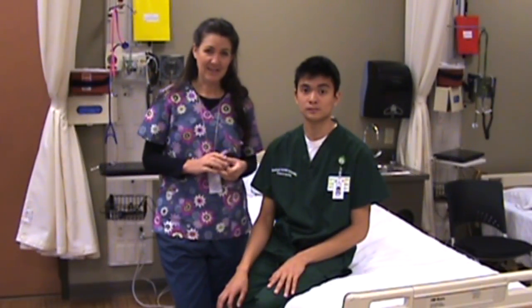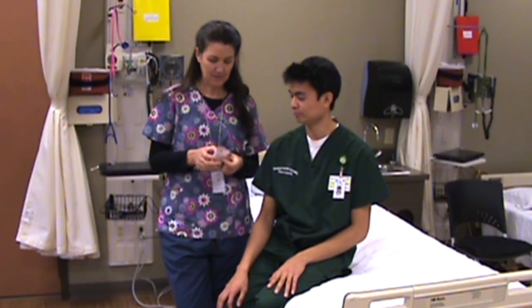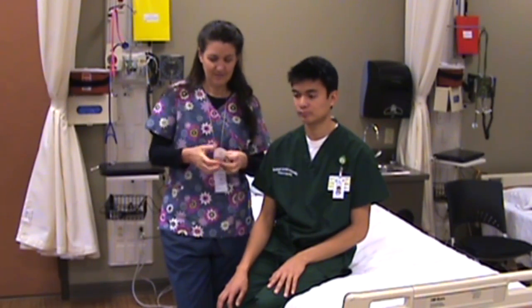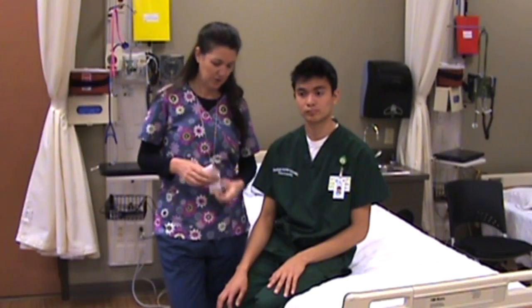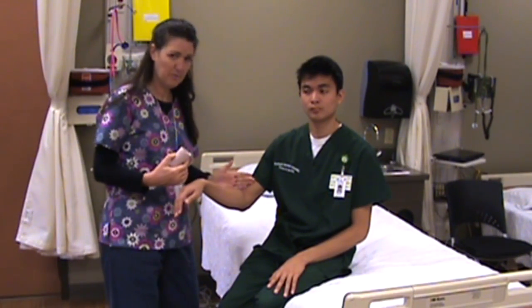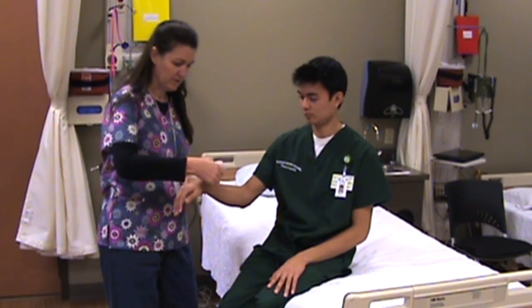I'm going to show you how to do an ace bandage wrap. And here's my ace bandage, and when you unwrap it to wrap the arm, you're going to unroll it this way instead of like this. Makes it a little easier. Now the first one I'm going to show you is just a little circular wrap, and we're going to wrap from distal to proximal, so it kind of pushes the blood flow up towards the heart.